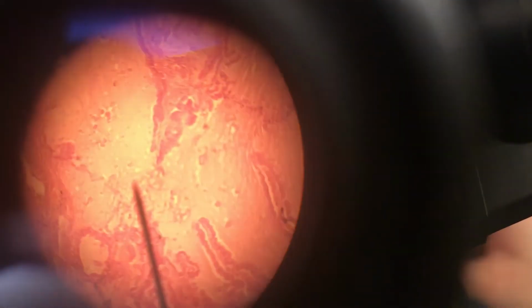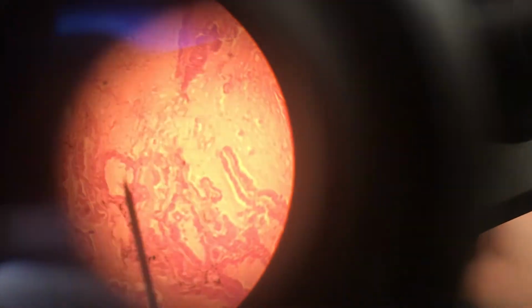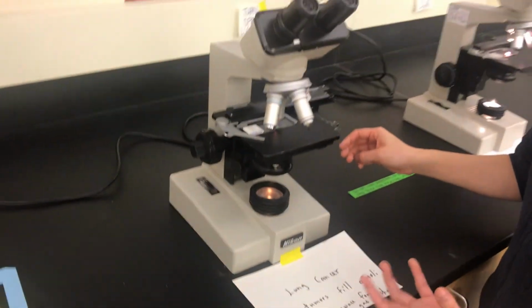Okay, so now we're going to take a look at a lung cancer tumor. In this particular example, let's see if we can zoom in on it. Okay, I'm going to move that around a bit. Okay, great. So you can see here we have some alveoli right there, but they're super thick and they're also completely filled in with this light pinkish cellular tissue. Okay, so because it's completely filled, there's no space for gas exchange. So that's lung cancer right there.